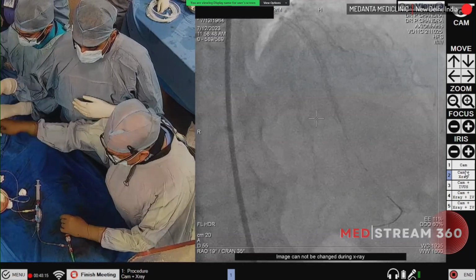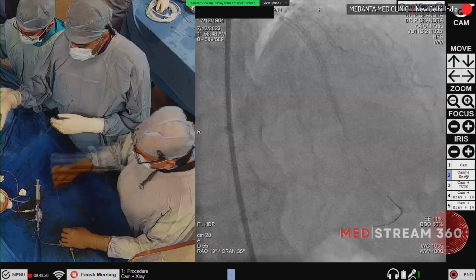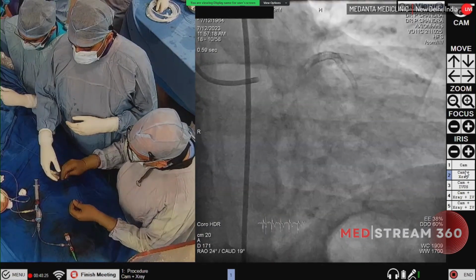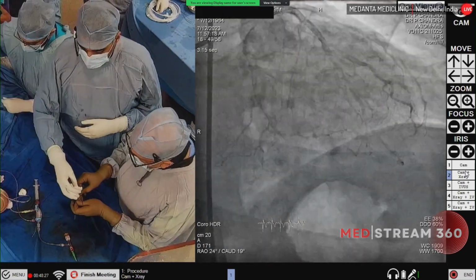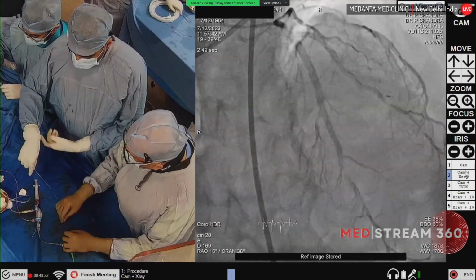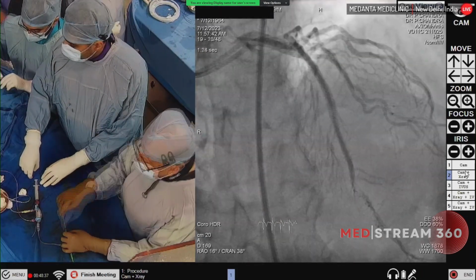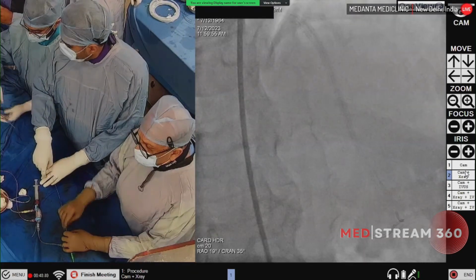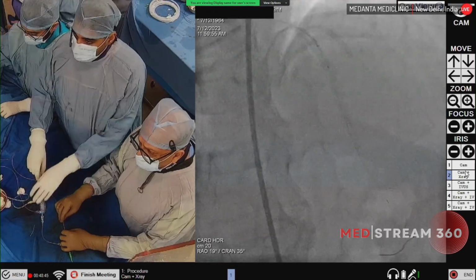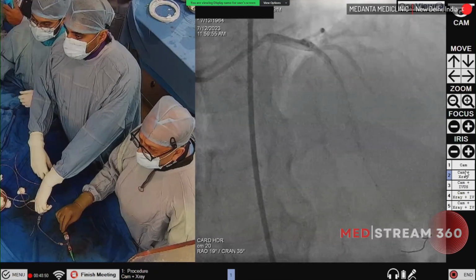Right. So we are taking the same 2 millimeter balloon first. 2 millimeter? Yes, 2 by 12. And this is a Mini Trek from Abbott. Is it a Mini Trek or an NC Trek? NC Trek. And hopefully it will cross. We will eventually do it with the same Wolverine 2 millimeter, but with such tight lesions, especially if the Wolverine has been used in the other lesion, it won't cross. Okay, check please.